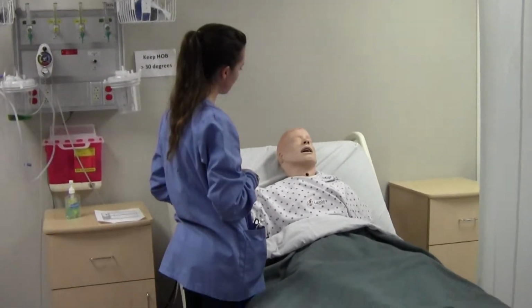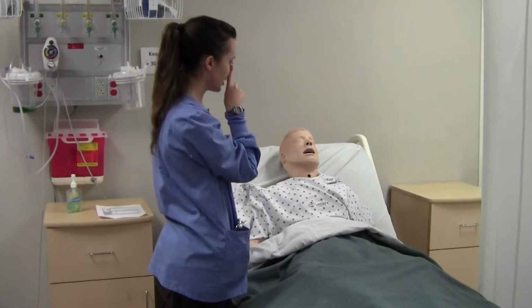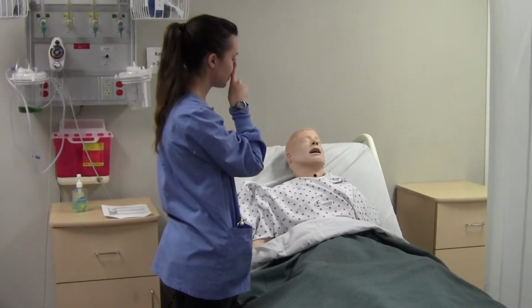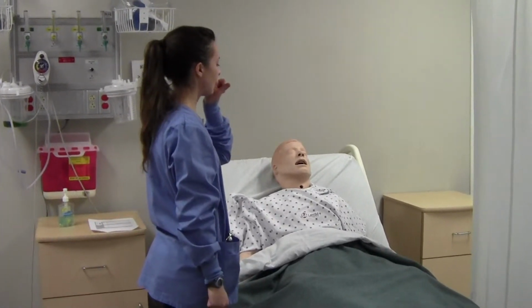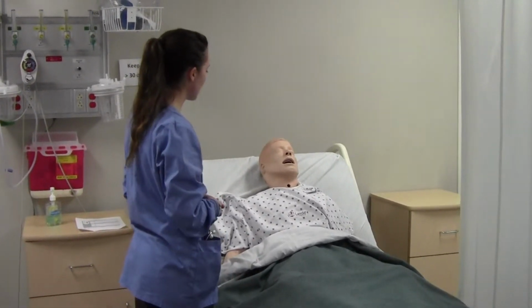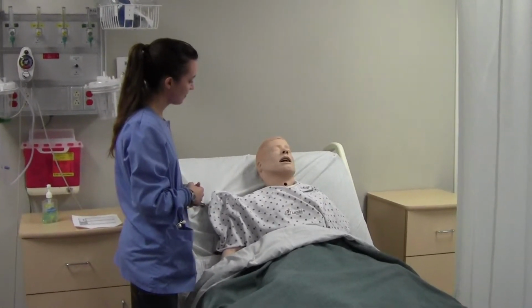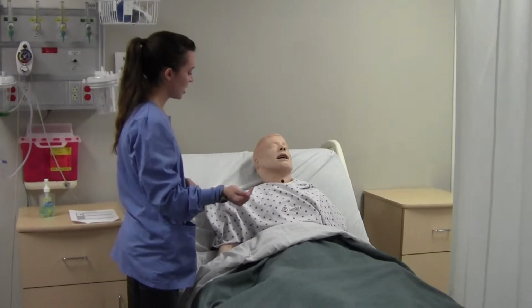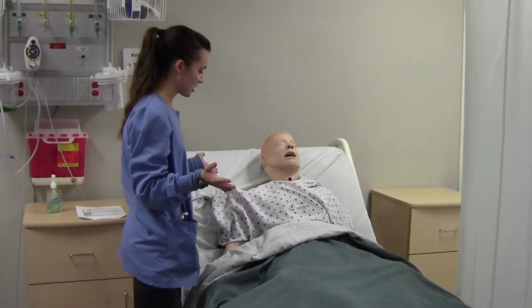No? Okay, perfect. Can you take your hand, please, and cover up your right nostril and breathe in and out for me, please? Okay, and can you do that again? Cover up your left nostril, breathe in and out for me. Okay. It sounded like your right nostril here was much clearer than your left. Am I correct with that? Yes. Okay, so we're going to be entering the nasogastric tube through this right nostril. Now I'm going to explain the procedure.